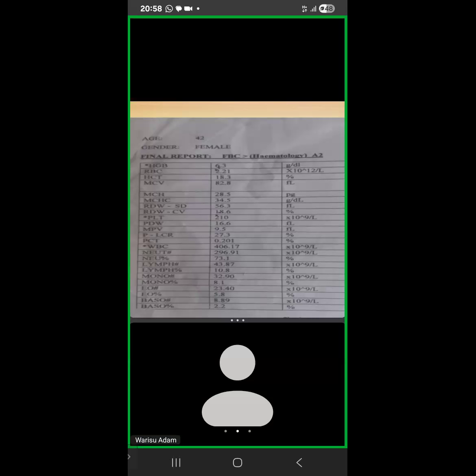Even though lymphocytes are also high, that of the neutrophil is too much. So I'll be thinking in the line of chronic myeloid leukemia. So you query chronic myeloid leukemia? Yes, please. So you got to be careful with words because you say presumptive. If you state chronic myeloid leukemia, it's a definitive diagnosis. Okay, so I will query chronic myeloid. You can't say chronic myeloid leukemia is presumptive.